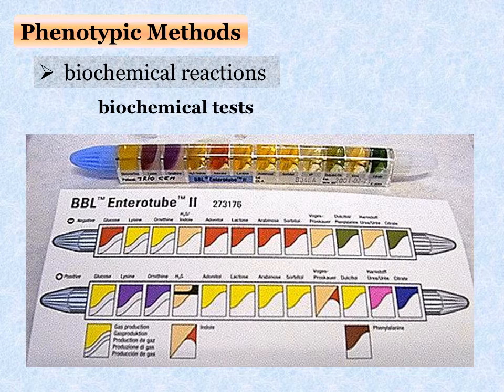The results pad and color reaction chart permit a rapid check of the positive reactions obtained with EnteroTube. The checked positive numbers are totaled and the composite number is then located in the interpretation guide to identify the organisms. When 2 or more organisms are listed, the confirmatory tests required to further identify them are also given.